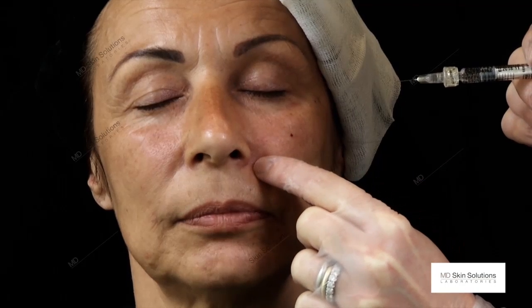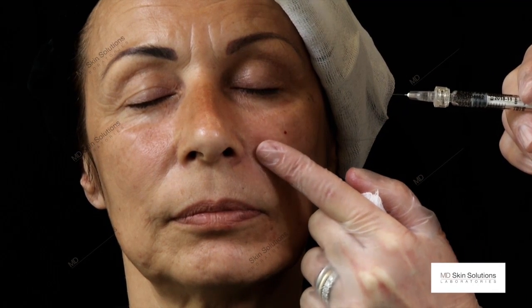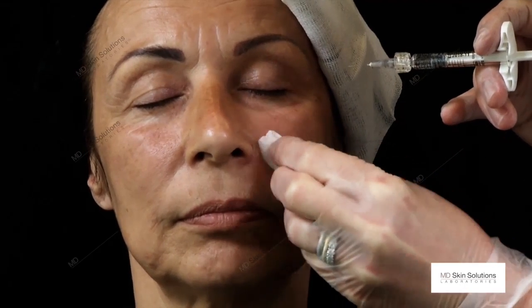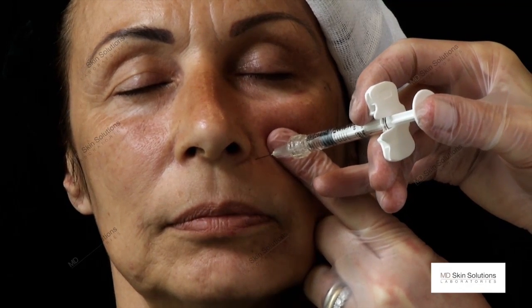The alar triangle is the next point of injection here. The idea is to soften this line and to give her a more calibrated look, erasing shades. So I do a one-shot bolus.